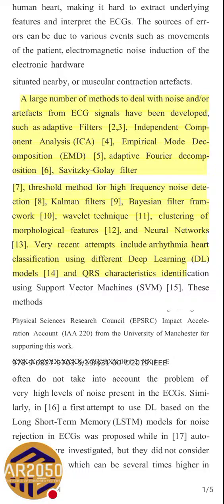In short, what it does is basically break down our signal into independent components, and we can remove a specific component from that signal. If we do a frequency domain filtration, we remove a specific frequency from the signal.